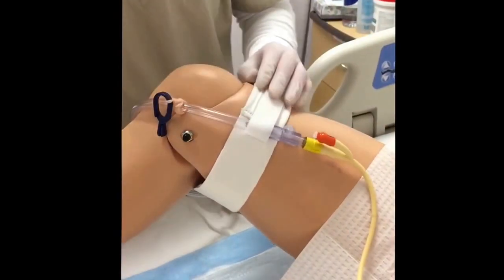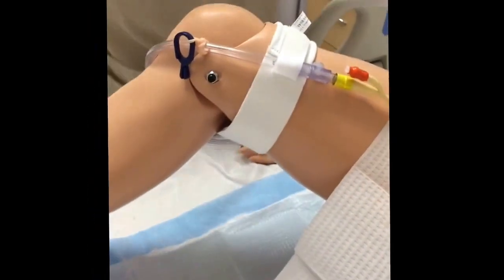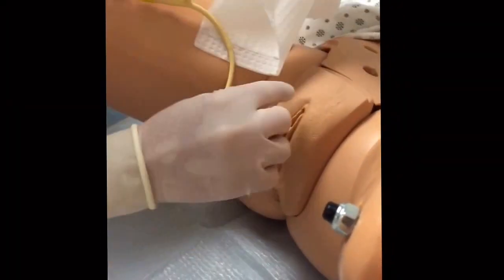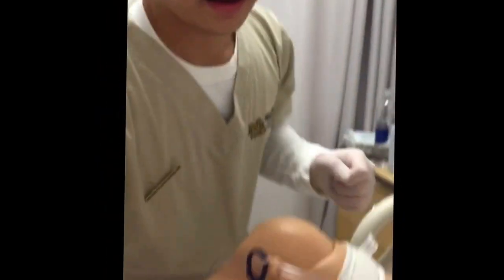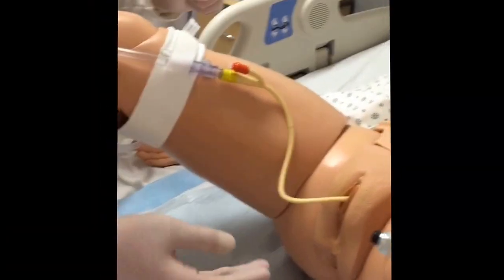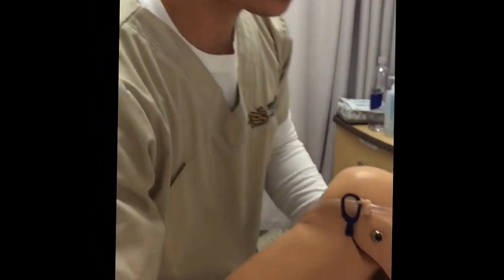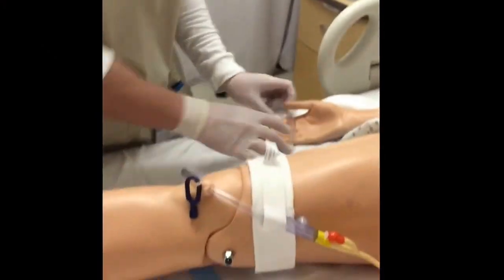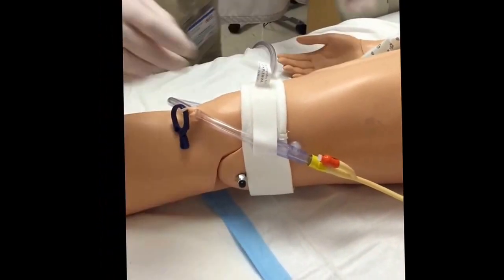Yeah, I'm okay. Alright, and you can go ahead and just clean all your stuff here, and if you take this off, please let me know. And if there's any lubricant gel here, you can go ahead and clean it off with a clean towel, and just check for any discharge or any bleeding. And she mentioned that she doesn't have any pain, so that means it's good. And now you can go ahead and relax your legs for me, and then make sure you always provide privacy after, and make sure that everything is all in and the tube is not in the way of any rail or anything, and it's all clear.